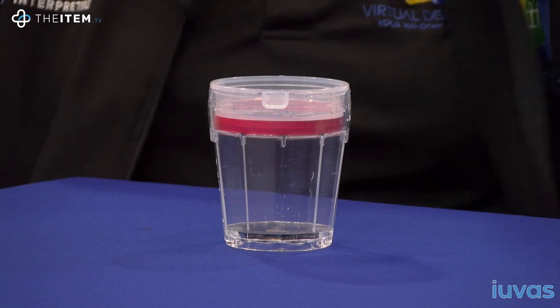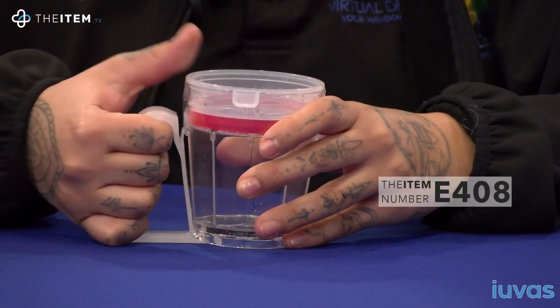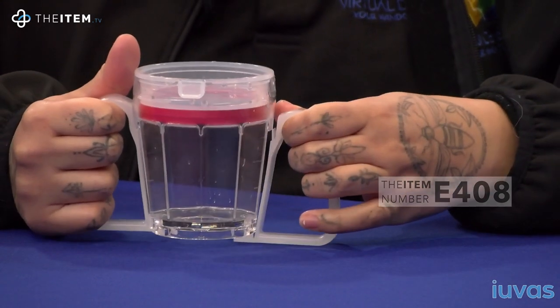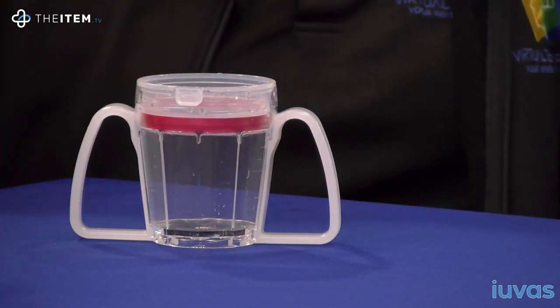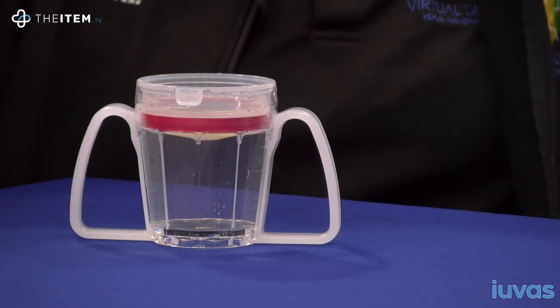Many people with dysphagia may also have other conditions which may make it difficult to use the cup in this form. With this in mind, the modular design allows you to add either one or two handles to help support those with tremors or Parkinson's disease, for example. There is also a spout to reduce spillage and control the flow of liquid.